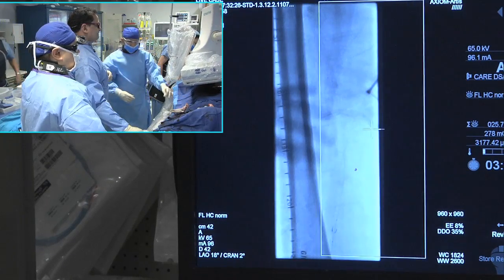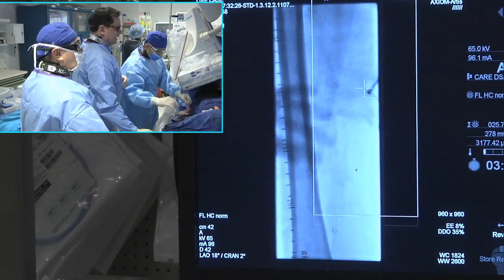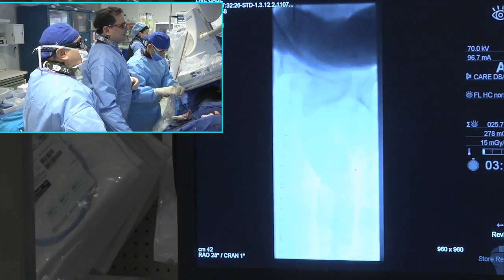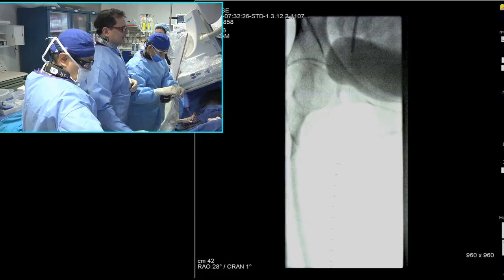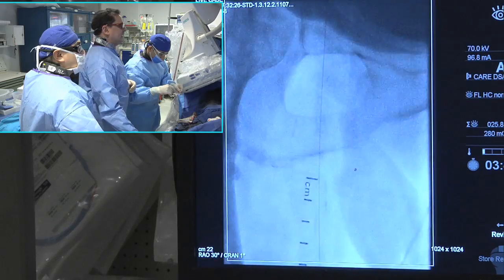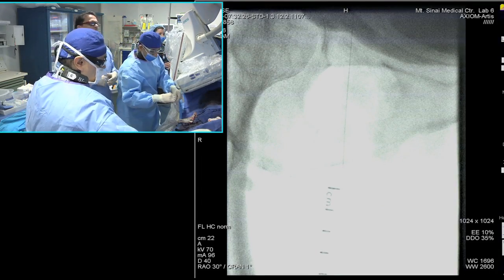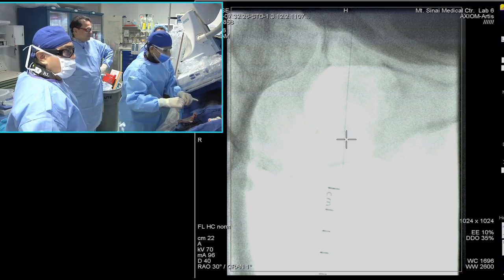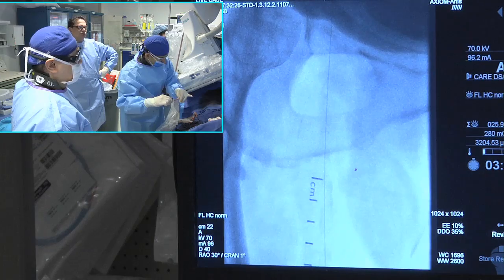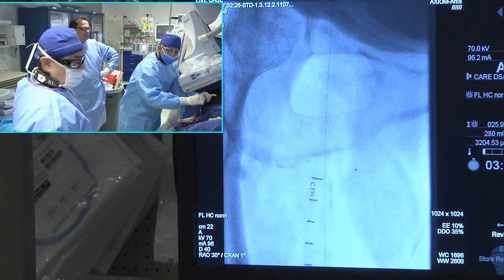So you could go with one stent over the other. You don't have any personal preference? Honestly, in my opinion, you should use a Supera. Other than the ostium, I think you should use a Supera. At the ostium, you can use any stent that you want. So I think that's our preference. At this stage, you saw there was a little bit of hyperlucency telling you that you're going to have to stent. There's a lot of recoil.